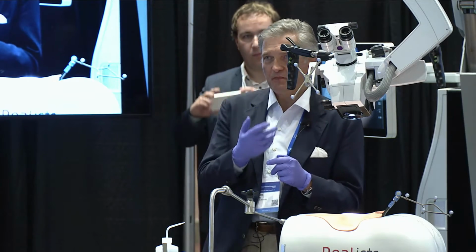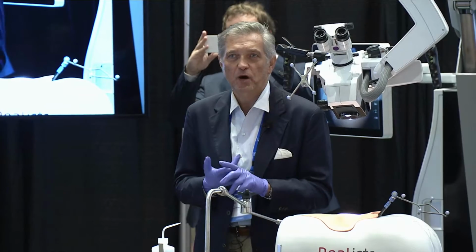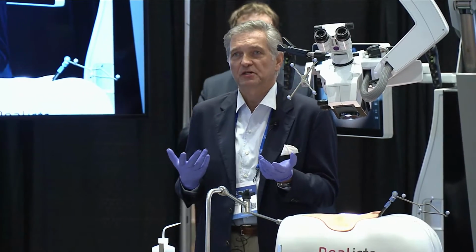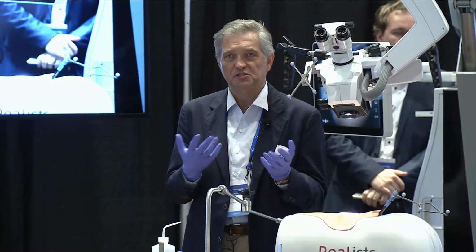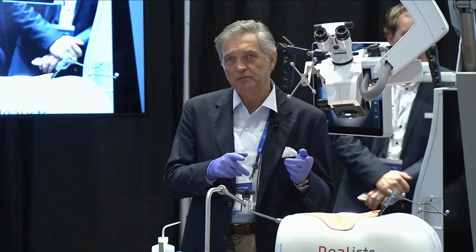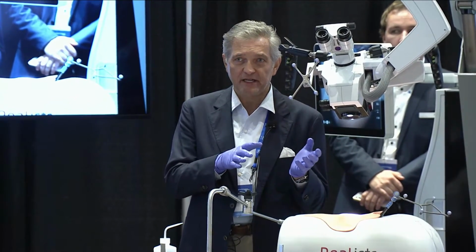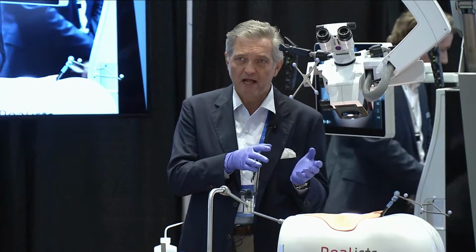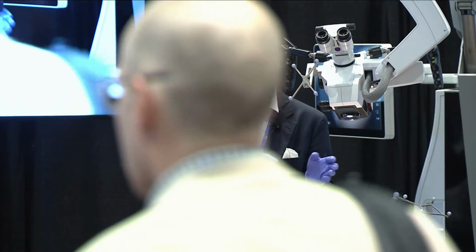Then obviously the microscope. I personally think, and again, our group where I practice, we all use the microscope because it just helps you visualize, it's safer, you can see all the critical structures. And now the combination of navigation and microscope allows you to integrate both, and we can actually use navigation or really augmented reality to show you all the particular landmarks for this procedure through the microscope.